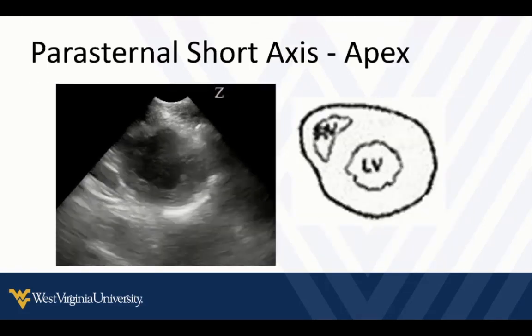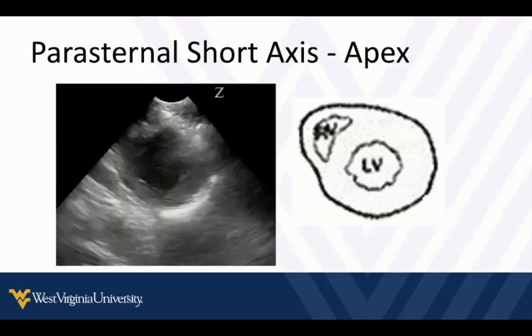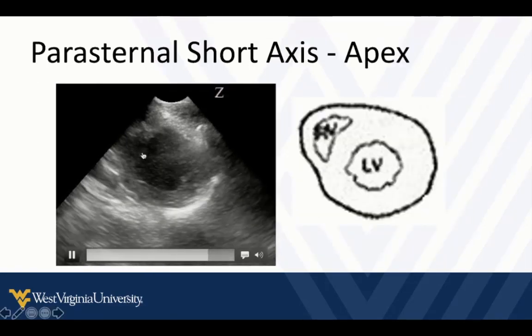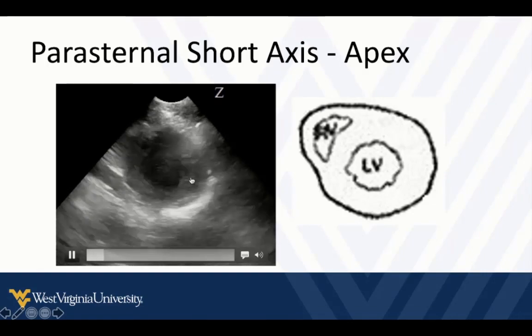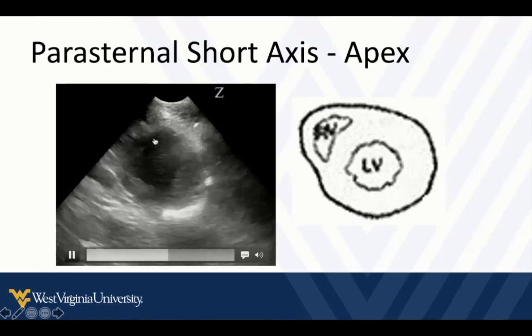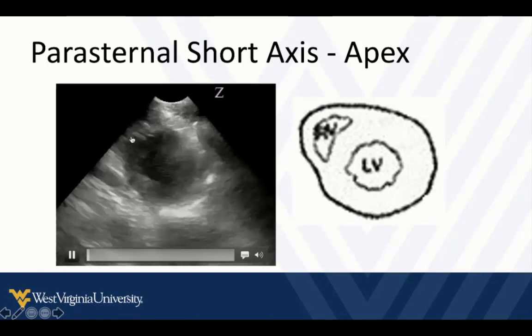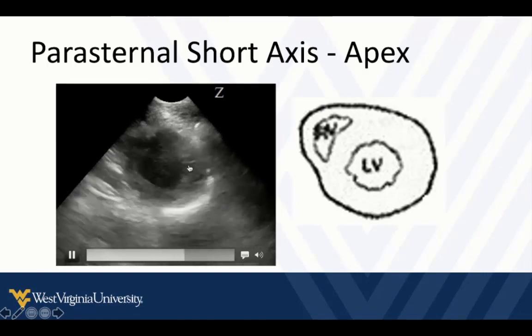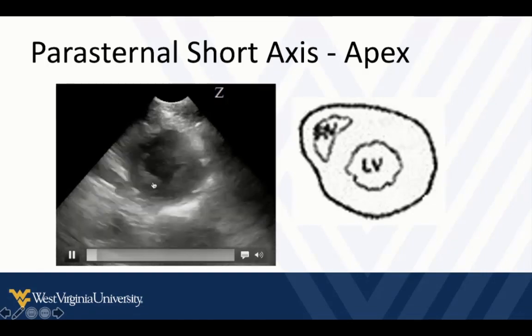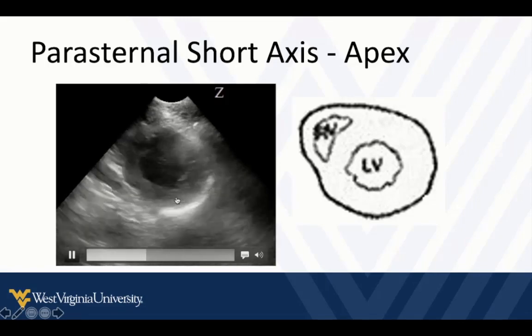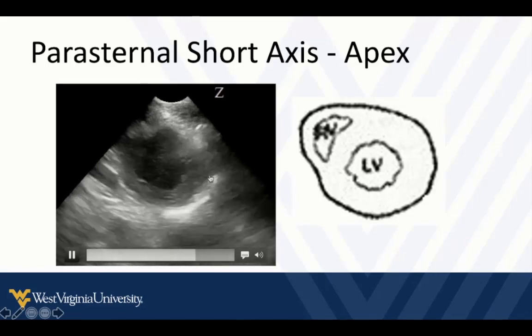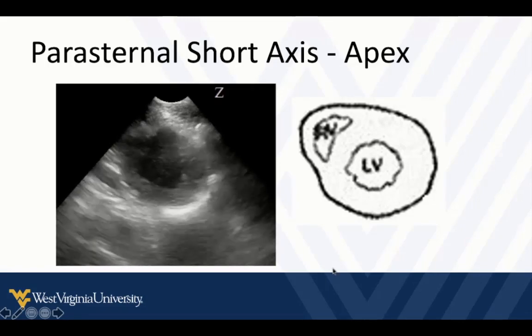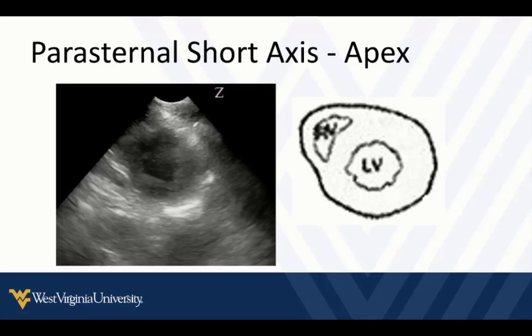In some patients we can slide out even further to get towards the apex, where we're past the papillary muscles and the right ventricle has pretty much gone out of view. There's just a little corner of it left, and we see a nice cross-section of the left ventricular apex. Those are the different slices we can get through the parasternal short axis.